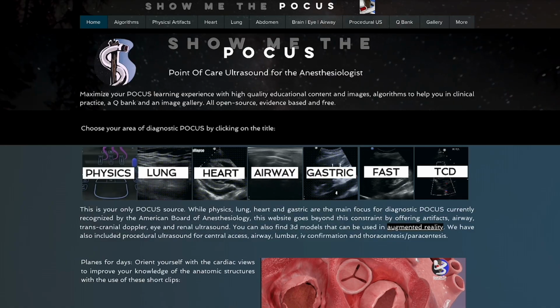I'll be referencing the work from Drs. Van de Putte and Perlas and their website gastricultrasound.org, as well as the ASRA.com newsletter.